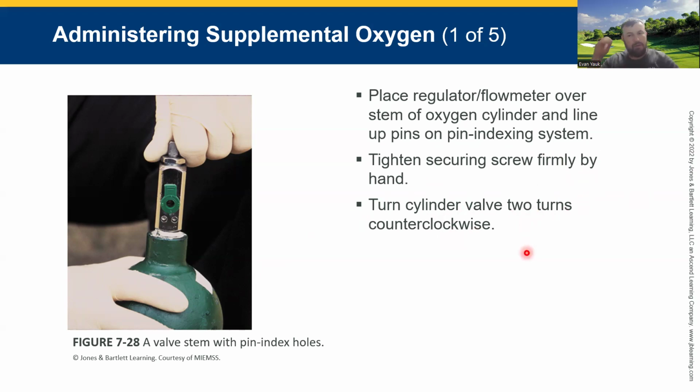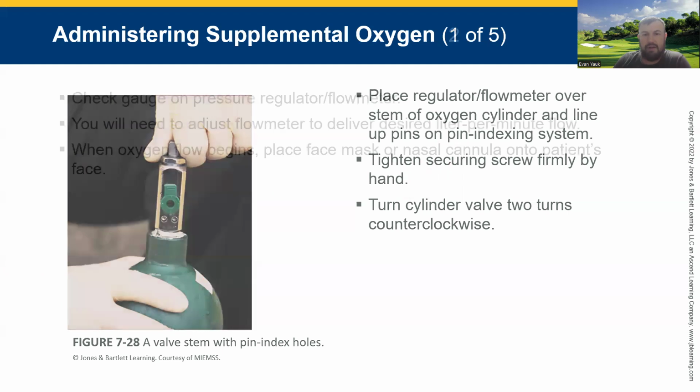So I'm going to stop right there. When we do our skills, this is one of the skills you have to do. Before you do this, we're actually going to crack that open and blow any debris out of the opening. If there's dirt or hair or grass or anything there, we open it just barely, just enough to blow debris out, and then we start this process, and we'll learn our skills when we practice it.